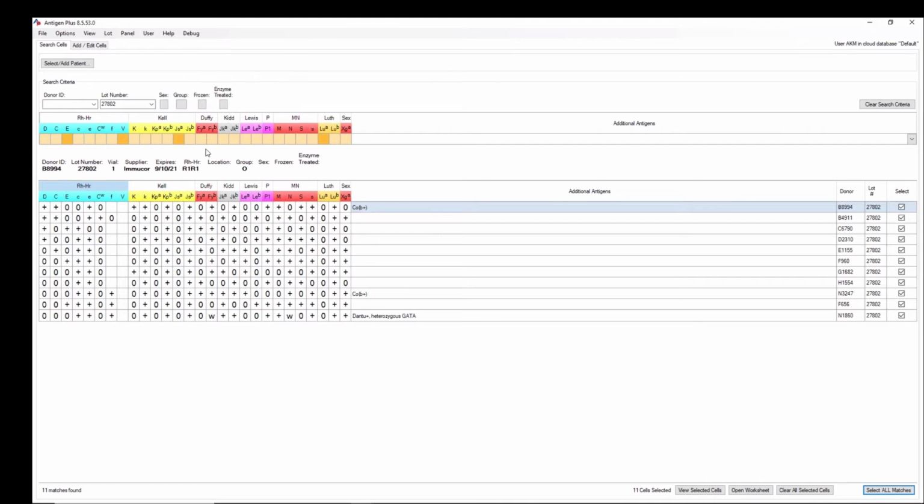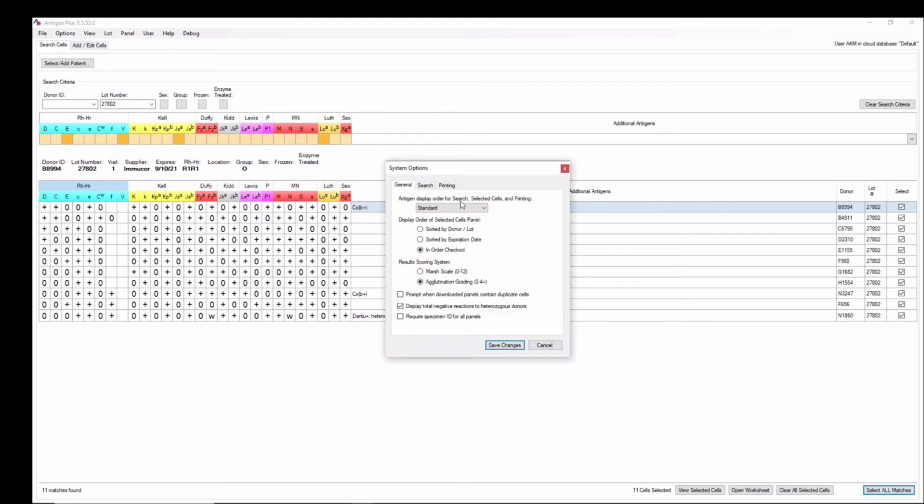No, I'm going to wait. Okay. So we've got, you can hook up your analyzer, and we'll talk about that in a minute. And there's a few things you can look for. Probably the way it comes is going to be the way you're going to keep it. But you can have any number of arrays for your standard work.